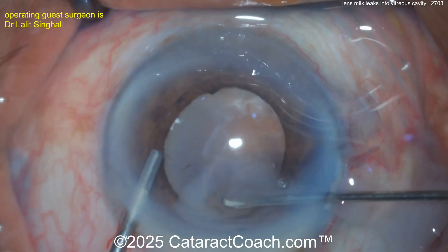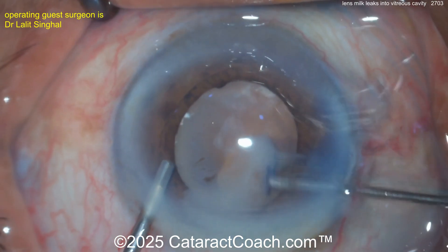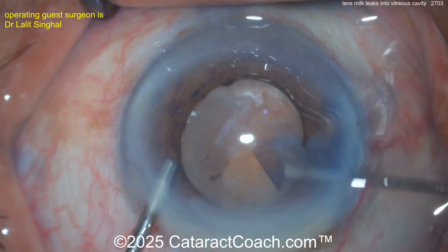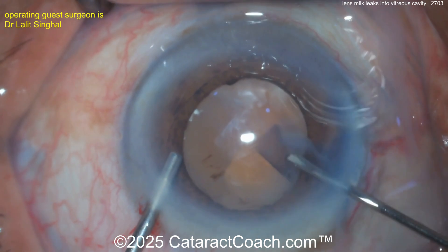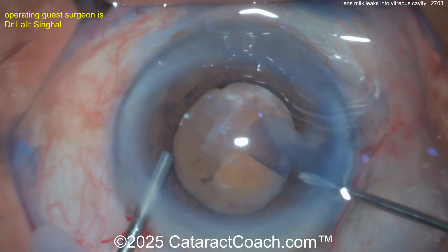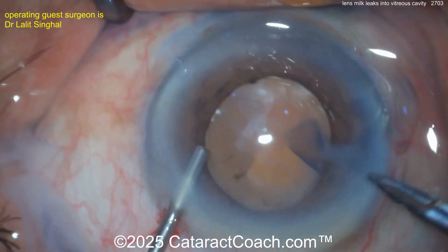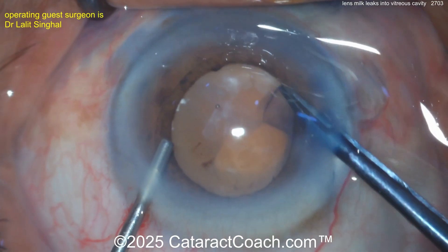Releasing it out of the eye, maybe putting more viscoelastic — looks like the left hand has viscoelastic. Continuing to get the capsulorhexis done. A tremendous amount of liquefied lens material; it could be almost a morgagnian cataract. Really a lot of lens protein liquefaction. Here we go, getting the rhexis completed.